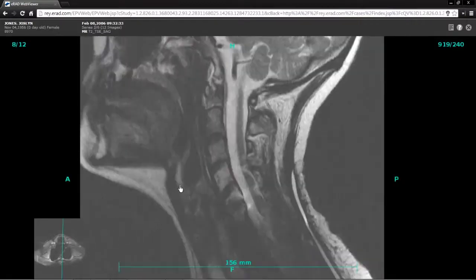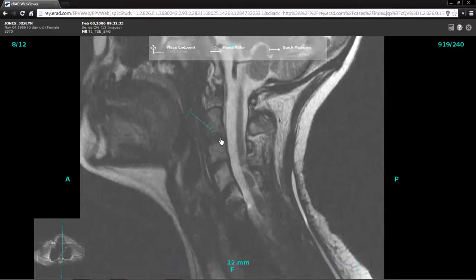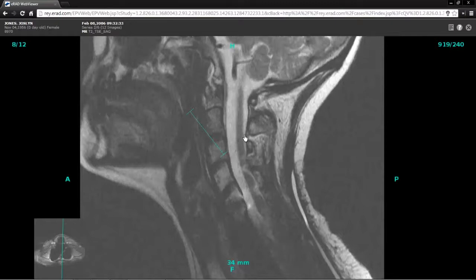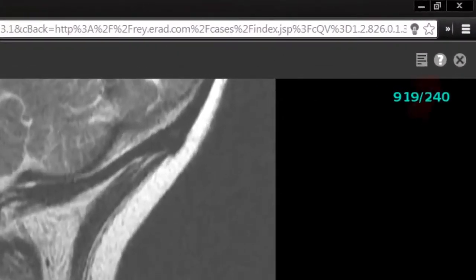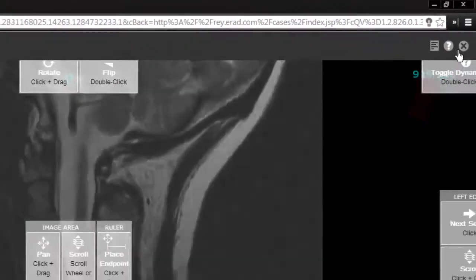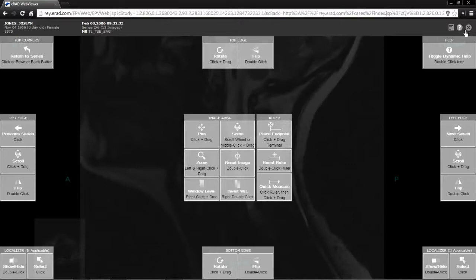There are cross-sectional references. Line measurements can be achieved by clicking on the line tool and then clicking and dragging over an area of measurement. Most features are location sensitive, available only when you click or drag on specific edges or areas of the viewer. Click the question mark icon on the top right to display all options available. Final reports, scanned documents, and key images can also be seen here. Please note, the device is intended for use as a diagnostic review and analysis tool by trained professionals such as radiologists, physicians, and technologists. This device is not intended to replace full workstations.